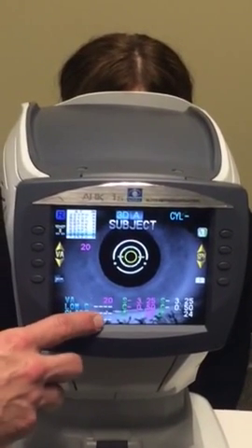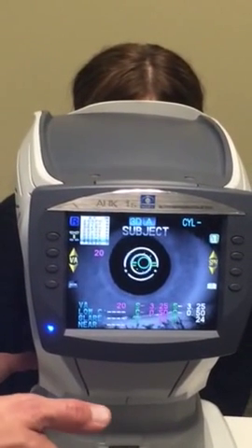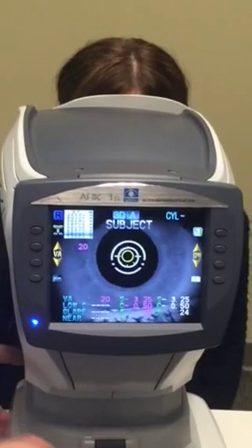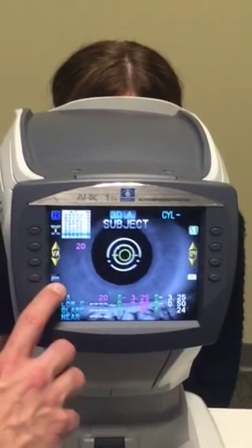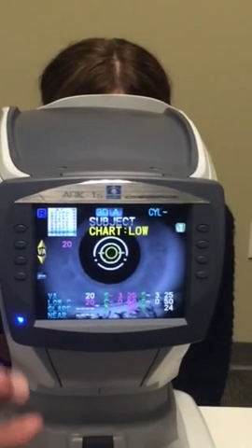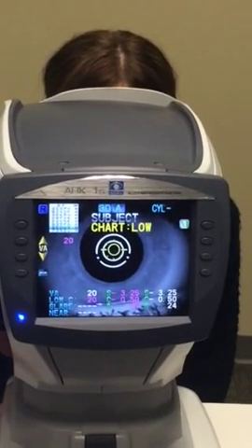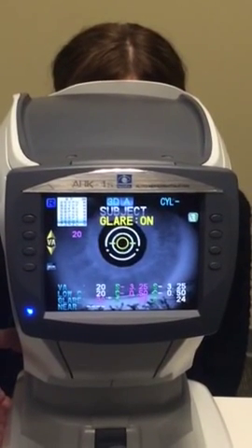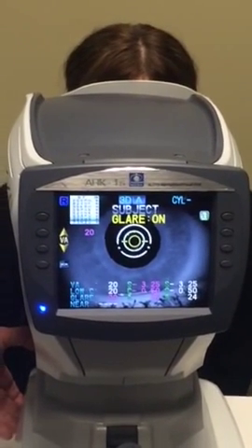That means when you take this patient back to refract, you're not going to deviate very much from that objective autorefractor reading. If I touch the E with the two lights on either side, first it's going to drop the background illumination of the chart to simulate dusk. When I hit it a second time, it's going to turn the glare lamps on.